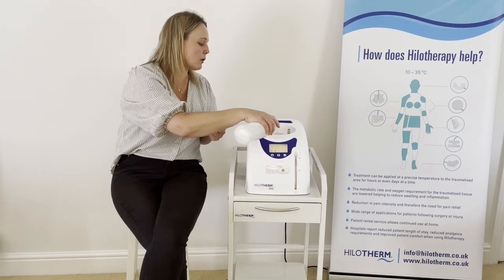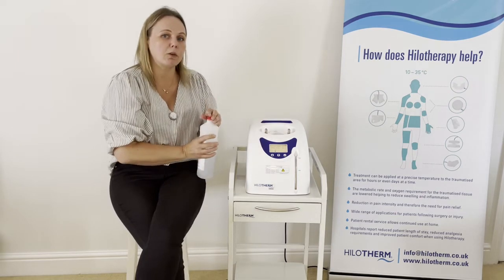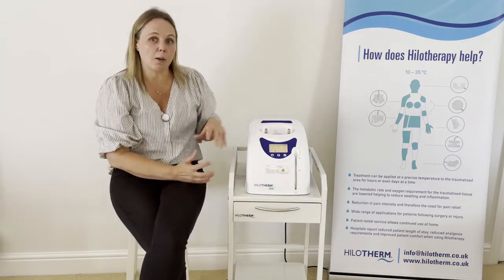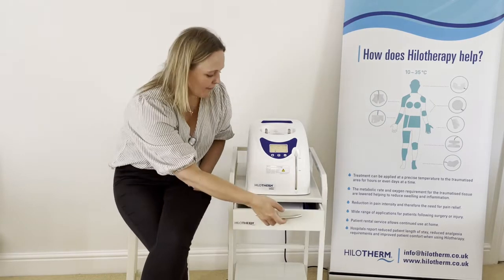You pour the water through the grate and the filter — that is how you top up. But as mentioned, you don't need to do that unless the device has alarmed and said 'error water level'.